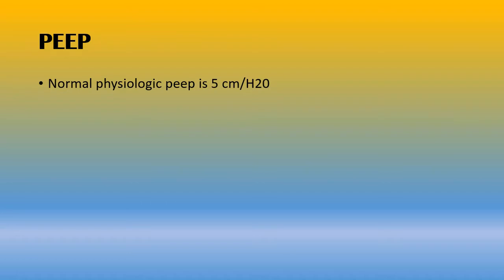Like we said before, PEEP is positive end expiratory pressure, basically the pressure left in the lungs after exhalation is complete. Normal physiologic PEEP is 5.